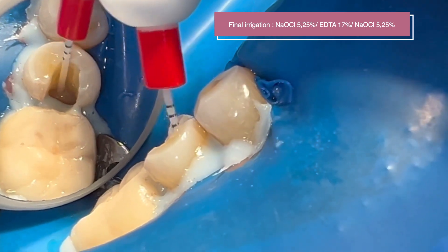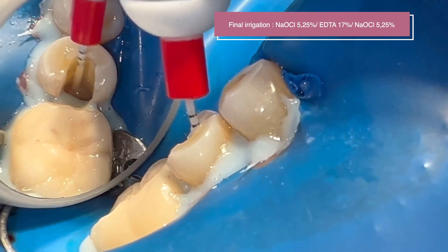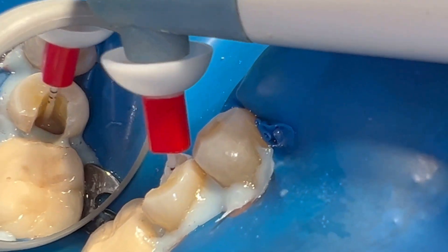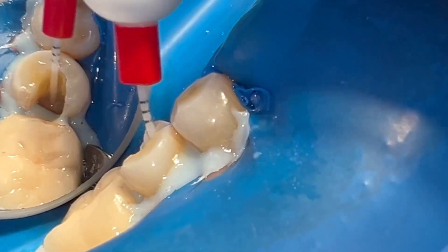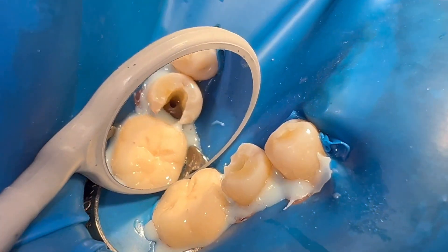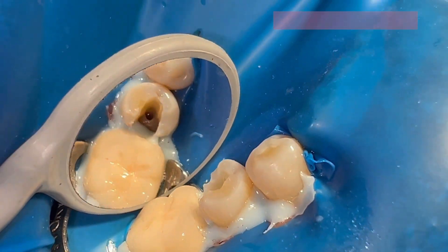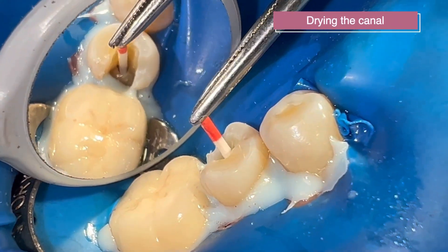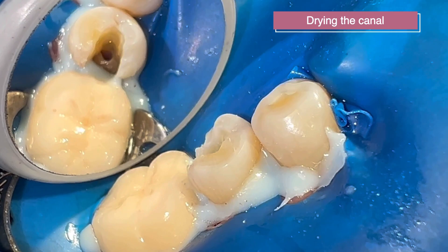We activate the irrigant with the endo activator. To dry the canals, I always use paper points at 4 or 6% taper.